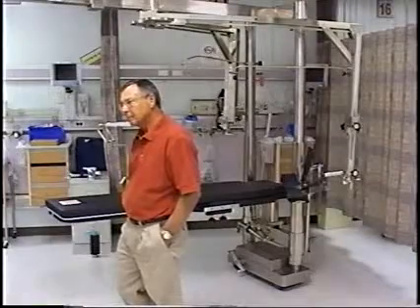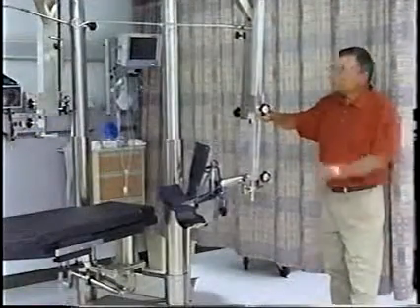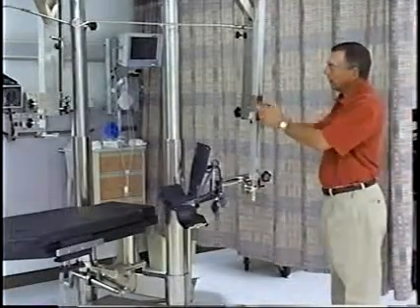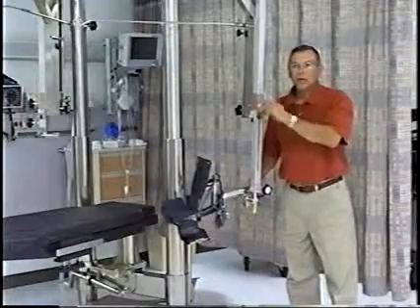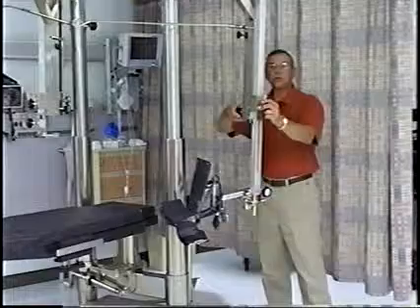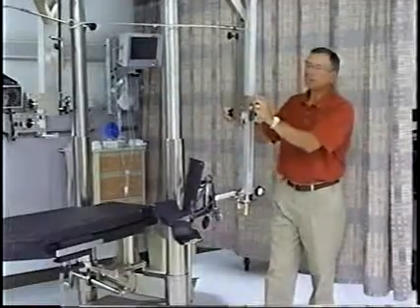Ted, one of the things that's always been frustrating for me is the clicking; sometimes you have to double click on the abduction. The raise and lower? Yeah. If you're going to raise it and lower it, all that's doing is, and this is already bent. Maybe it's not that one. It's the other one to make it slide in and out. Oh, the lengthen and shorten? Yeah, lengthen and shorten. Okay. And that's just because it's an older table. Yeah, it's an older table.